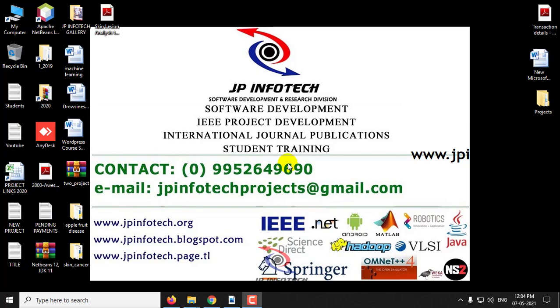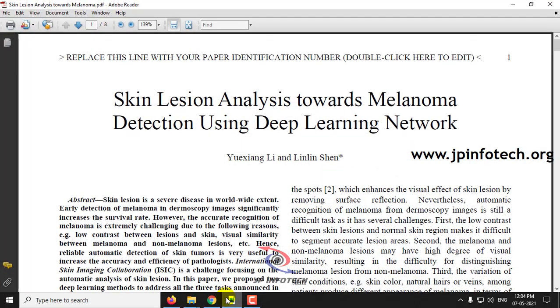Hi, in this video we are going to see about a Python project entitled Skin Lesion Analysis Towards Melanoma Detection Using Deep Learning Network. So let us see the execution of the project.